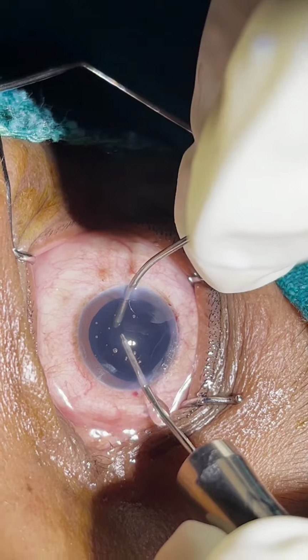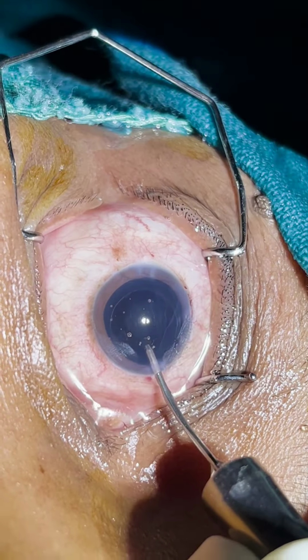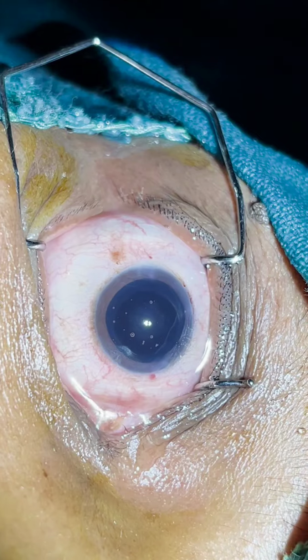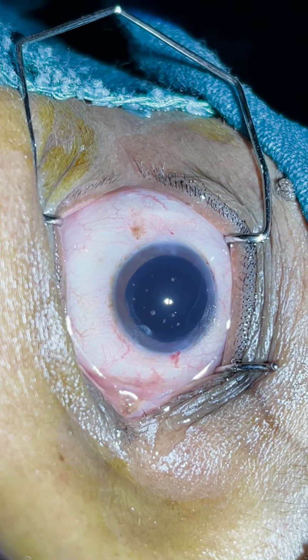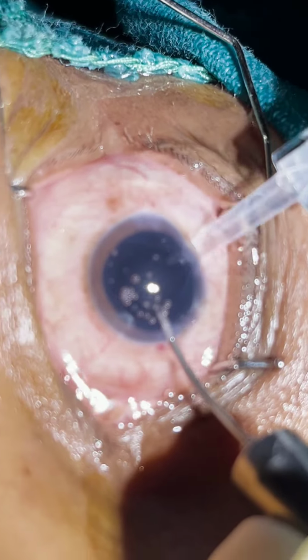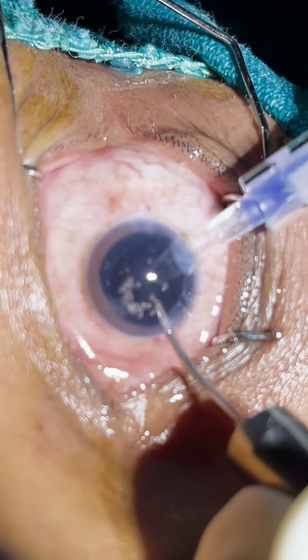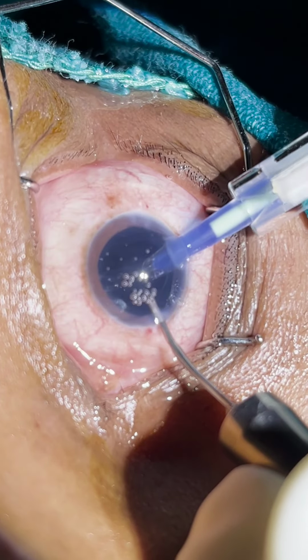Very early post-op, in a few years. So nicely I cleaned the posterior capsule by polishing it. We can do that polishing also with a dialer, or there is a PC polisher also available with a rounded tip. With that also we can do PC polishing.